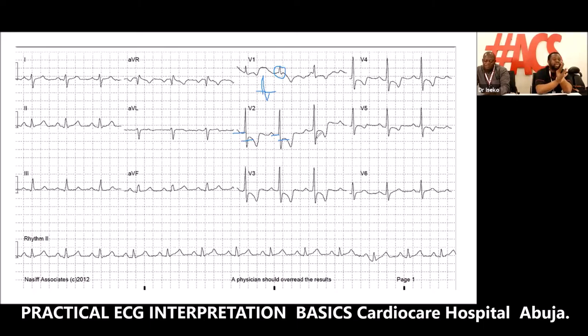If someone just says, doc, take this ECG, report for me, you just get garbage in, garbage out. We will just report ST elevation, ST depression. You cannot say anything. But when you bring the clinical context, that is where you can say this or that.